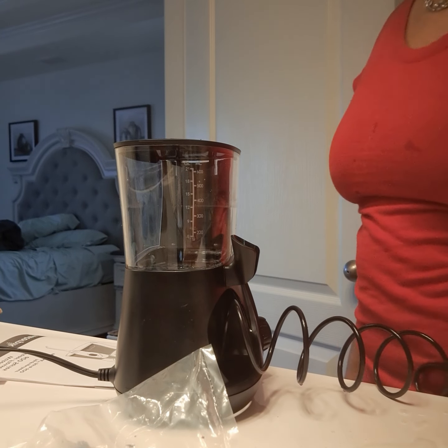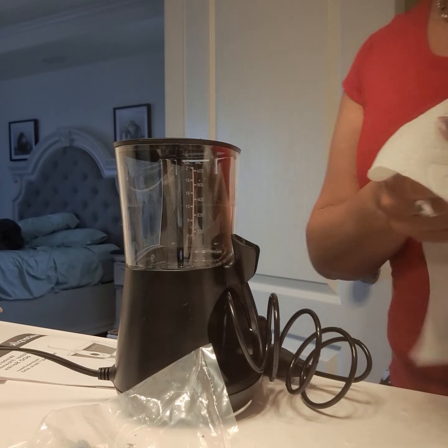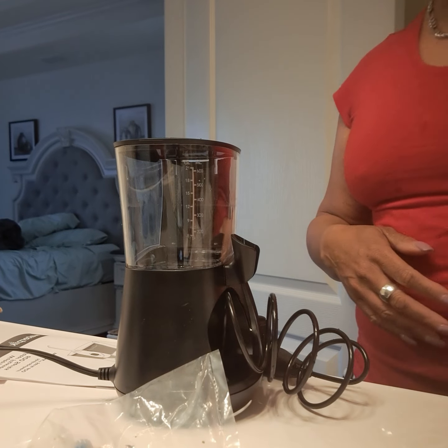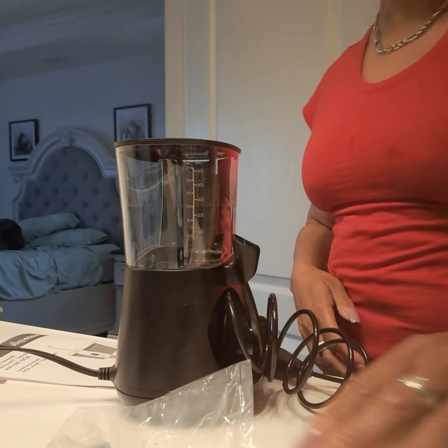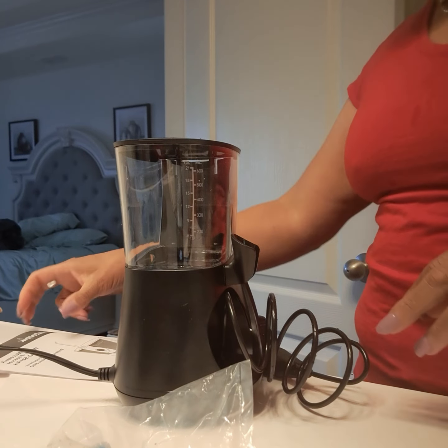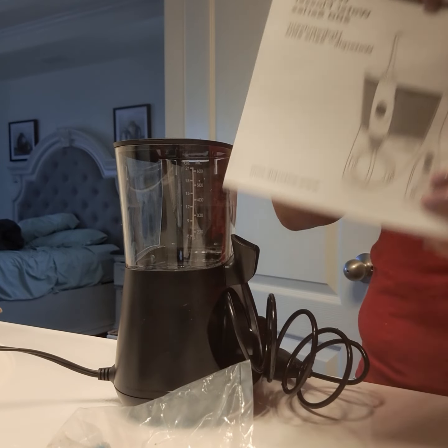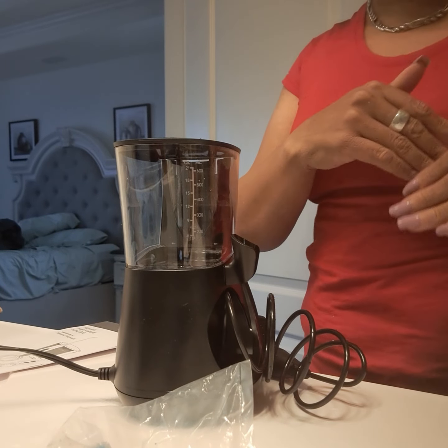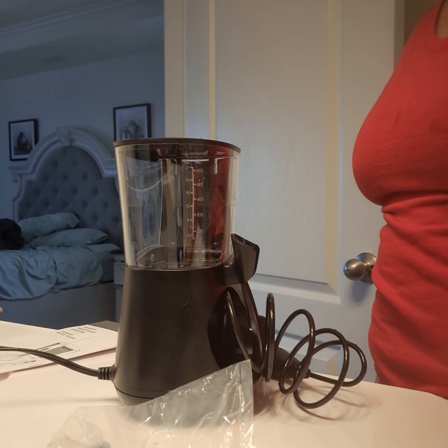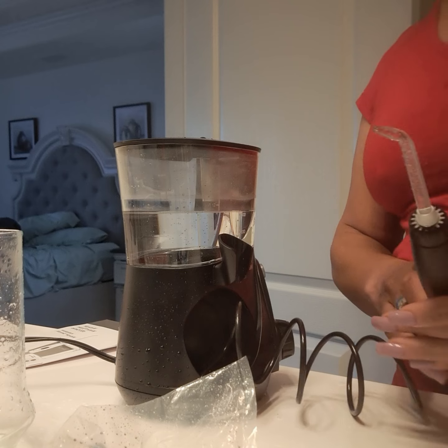A little messy — scratch that, a lot messy — unless something I'm doing wrong. I didn't bother reading instructions, but my dentist suggested I get a water pick, so I got this one. I'm going to try it again off screen and come back and let you know if you should get one.